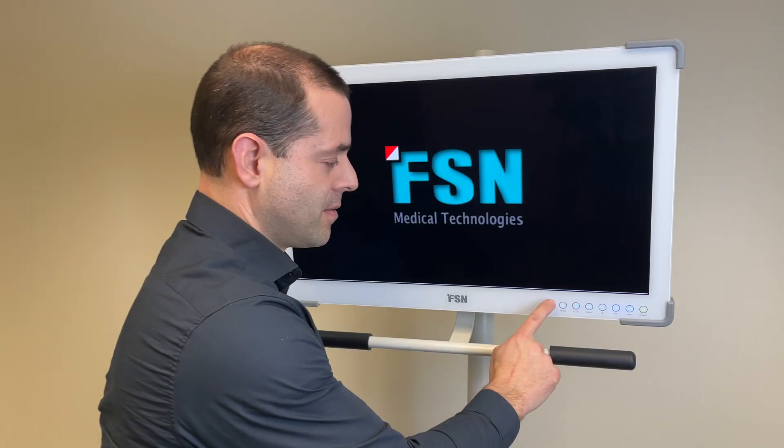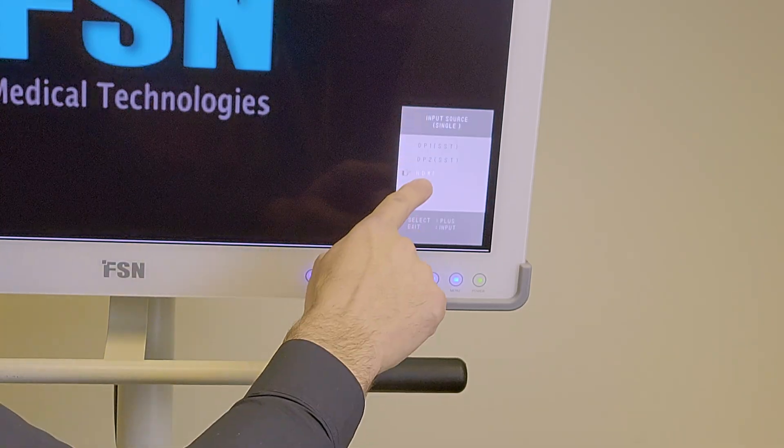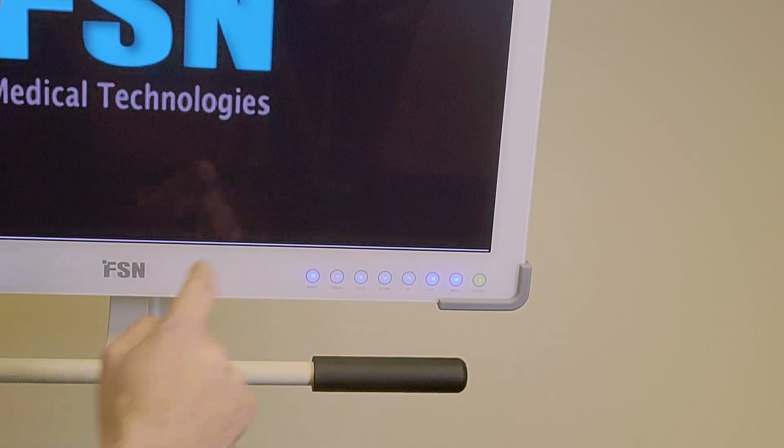For input, tap it once. Choose the input that you want — HDMI — then select or press plus.